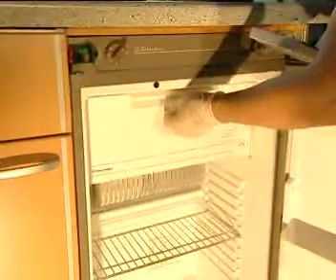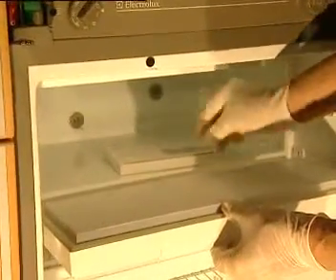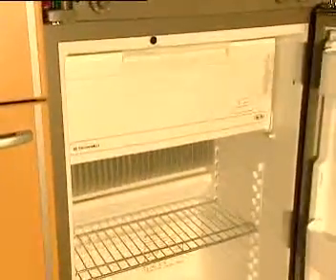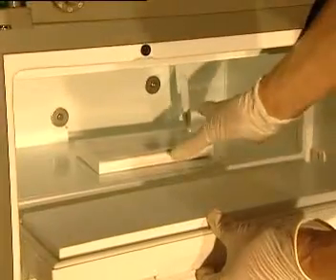A chain of cold storage during the transport of Epiglu is not necessary, and also not for the repeated use within a day in big private practices or emergency rooms. Especially if Epiglu is not commonly used, we recommend to store opened or unopened tubes as cold as possible.